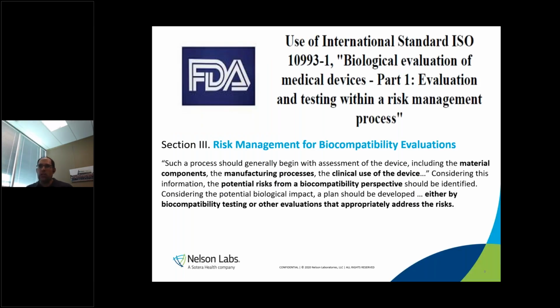So we actually used the FDA, not draft this time, this is actually a guidance document. So it was released in 2016, reissued in 2020. There wasn't a whole lot of updating, but it's a risk management of biocompatibility. I'm sure if you're on this webinar, you guys are very familiar with this document.